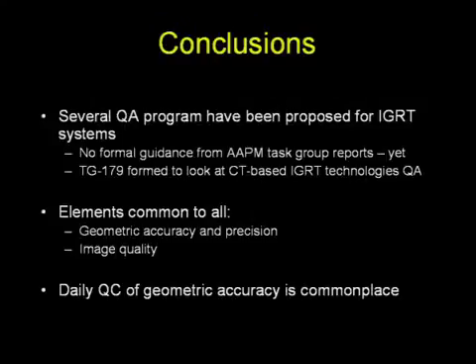So to conclude, QA programs have been proposed. They focus on geometric accuracy and image quality.